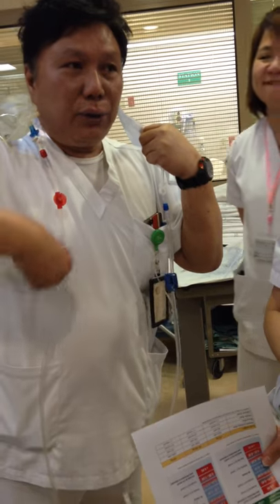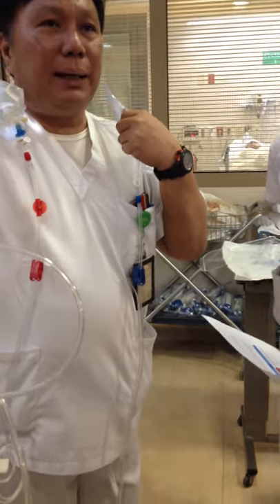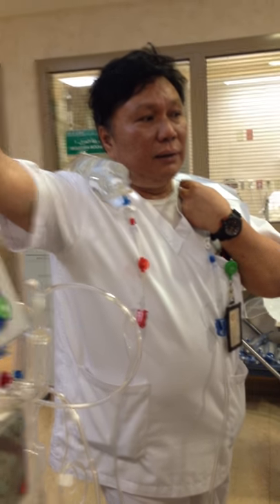Before it enters, it infuses calcium already. Because you know why? The calcium in your lines is being chelated. The simplest meaning of chelated. Could you explain, Marcel, please? Chelate. This is a learning experience, you have to understand what we're doing.